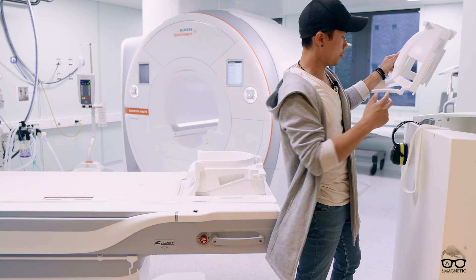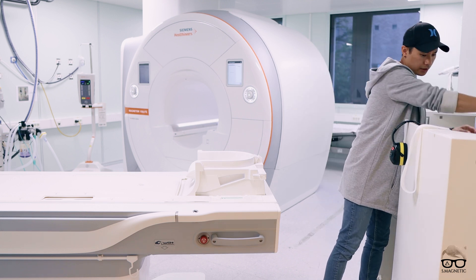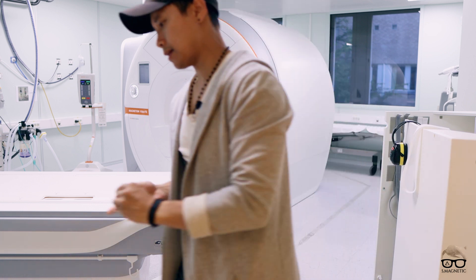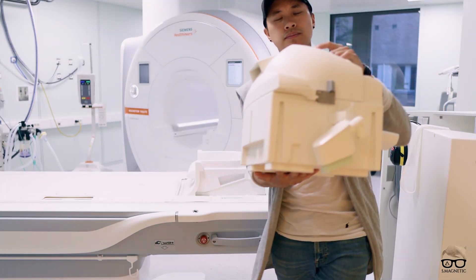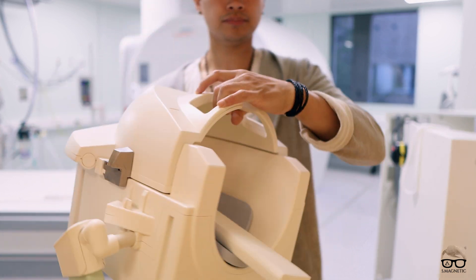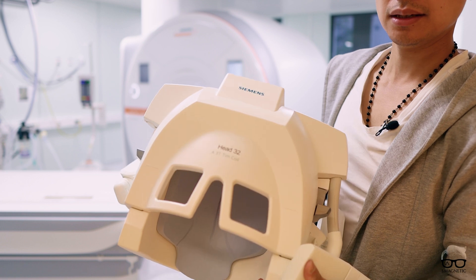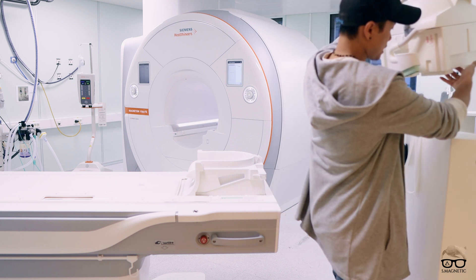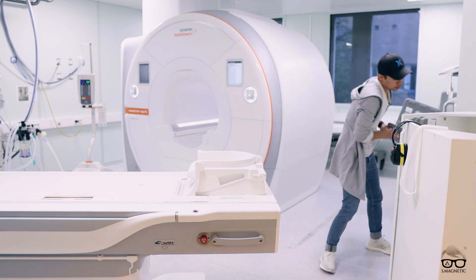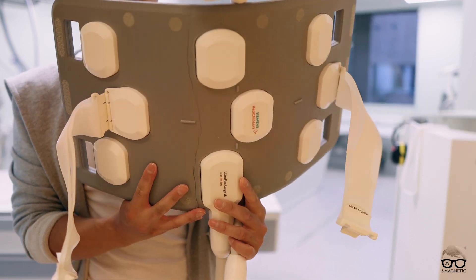That tiltable coil is new for us. Another thing I want to show you is the 32-channel head coil. This one is very dedicated for the head and brain only, so we use it for epilepsy cases and dedicated neuro cases.